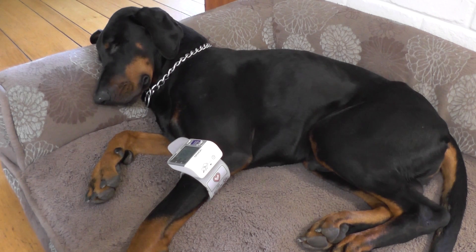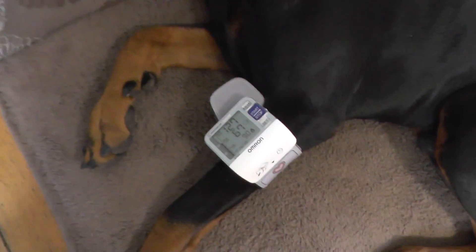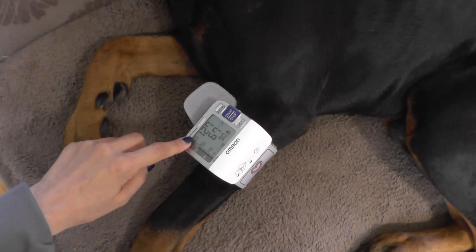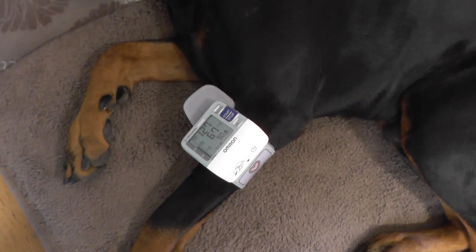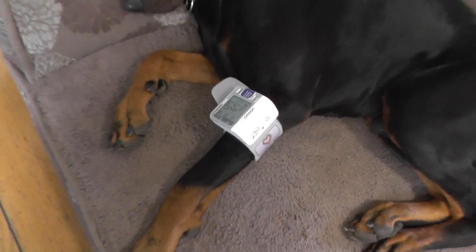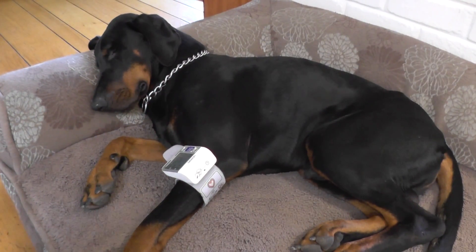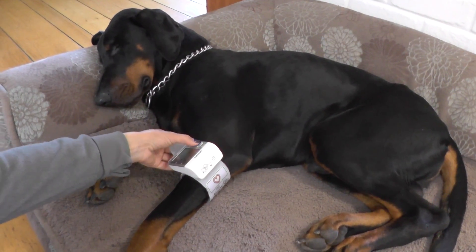I usually take about a dozen tests within a 10-minute period and average the number. Right now you can see he has 127, which is the systolic number and it's a bit high for him. I was measuring it about half an hour ago before I started filming, and his blood pressure was around 110, which is normal.